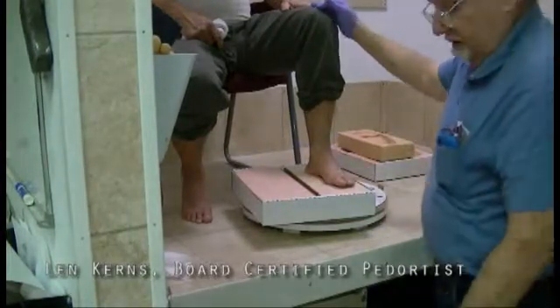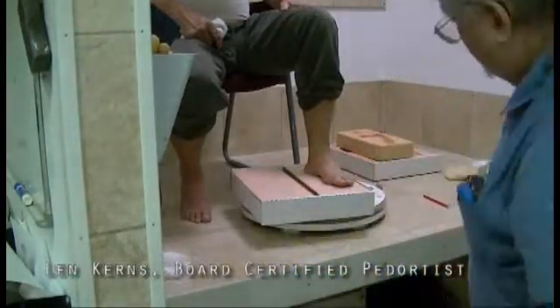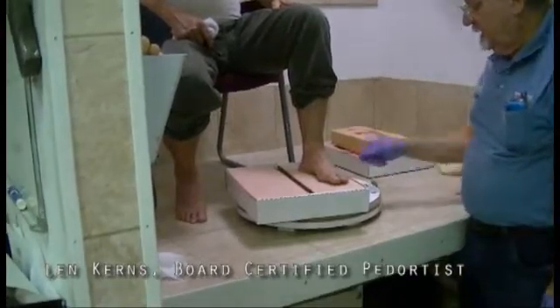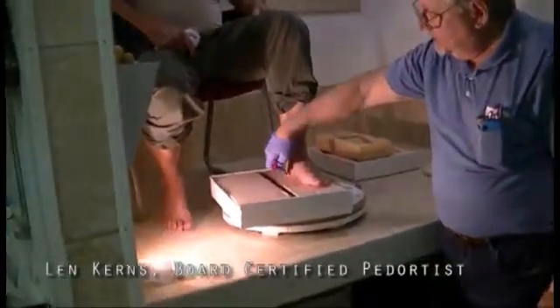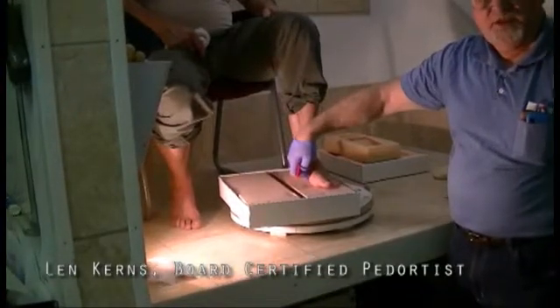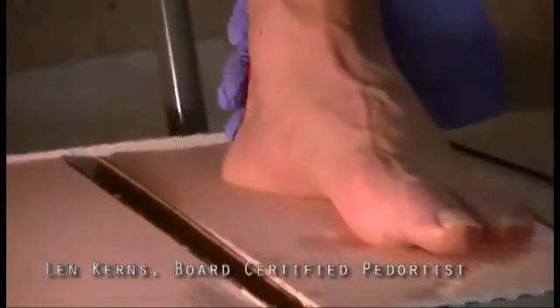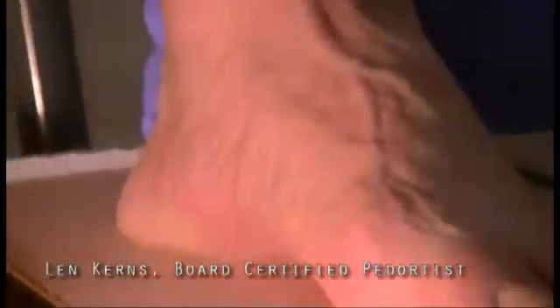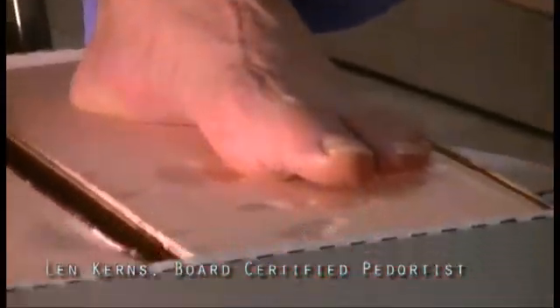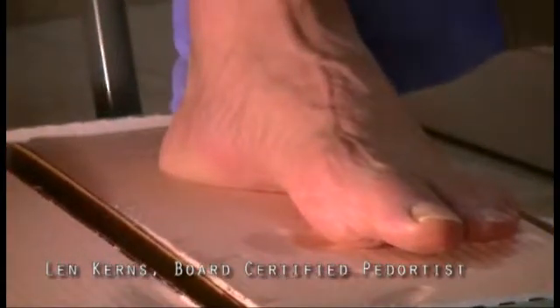And now I want to plug this light in so you can see underneath the foot. At this point, the arch is as high for this individual patient as it should be. The ankle is in subtalar neutral. If I put this red pen behind it, it gives you some idea that the heel is in the center of the Achilles tendon. I would like to put a camera behind it, but it's very difficult.